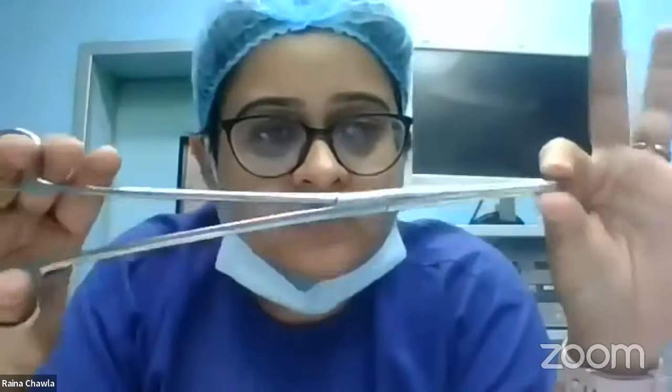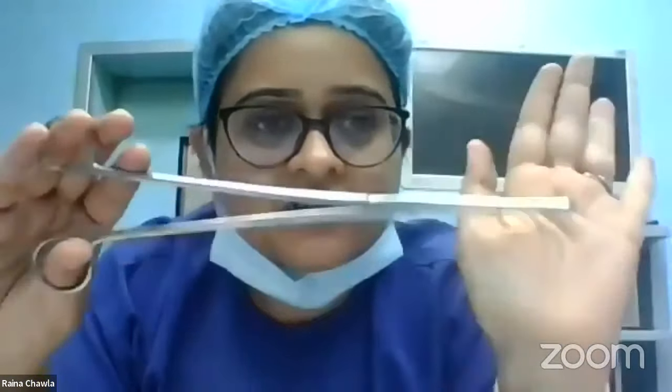Okay. Suppose you don't have this also with you. We don't have an MVA. You don't have a suction apparatus, and a patient comes bleeding, incomplete abortion. Okay, what will you do? You say you're in a very low resource setting, you don't have any of these, or your MVA is not functioning, it's malfunctioning. What do you do? We'll use this instrument to remove the products of conception.